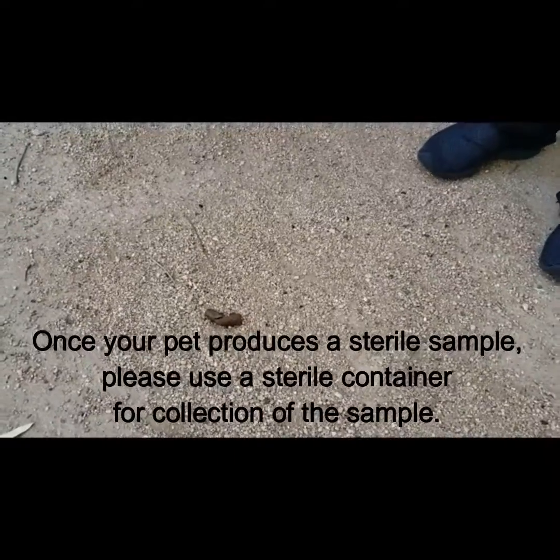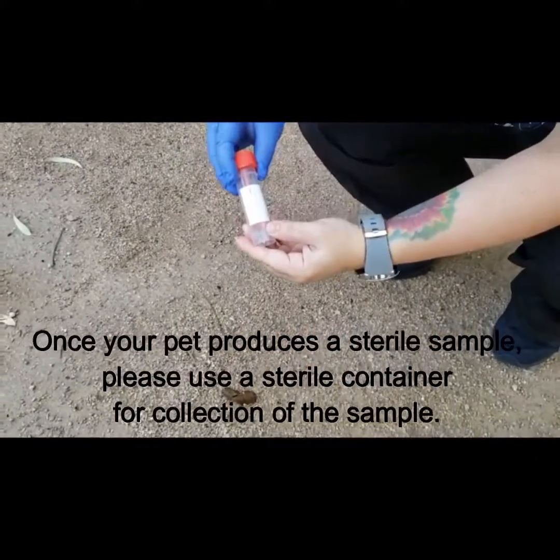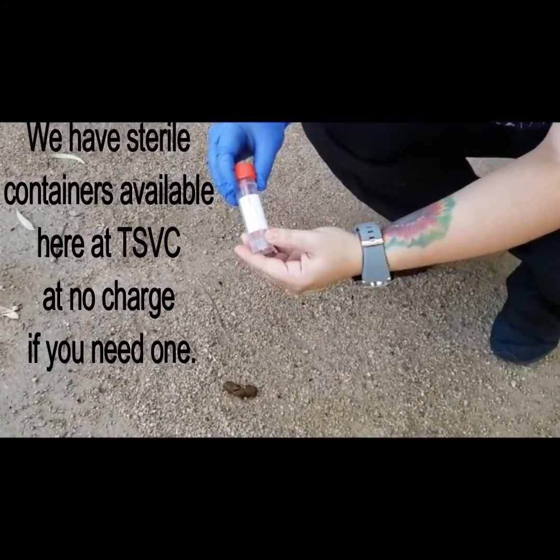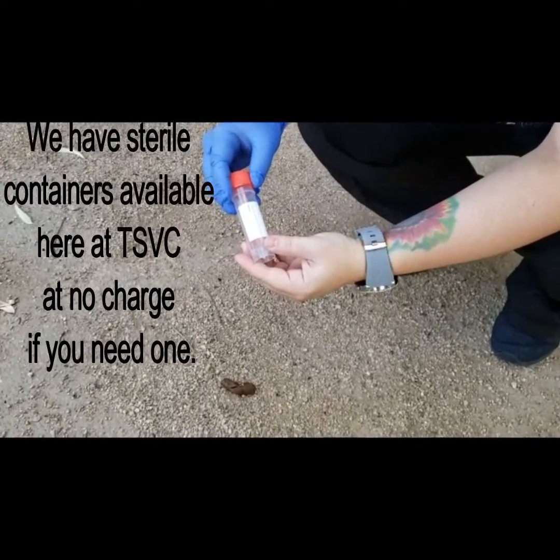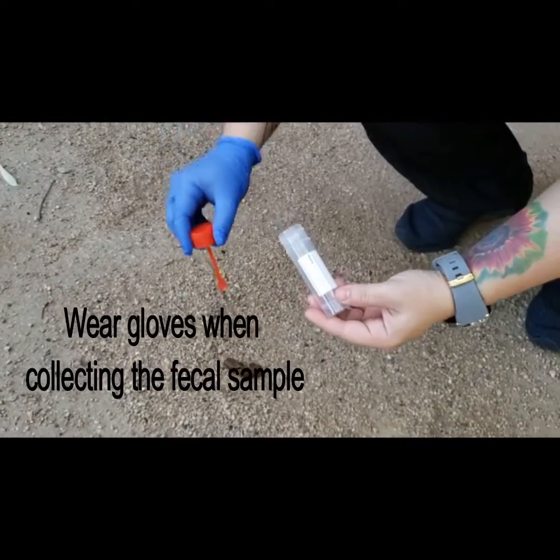Once the sample has been produced, you can put it in a sterile container. We have these at the Scottsdale Veterinary Clinic at no charge if you need one. Otherwise, use a sterile container or a baggie. On the end, it has a little scooping device that we can pick up the specimen with.